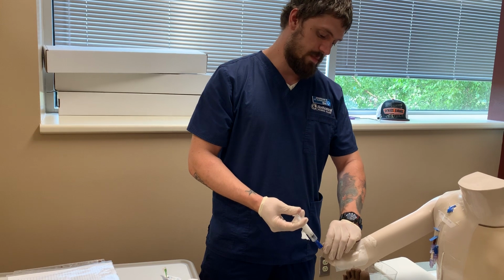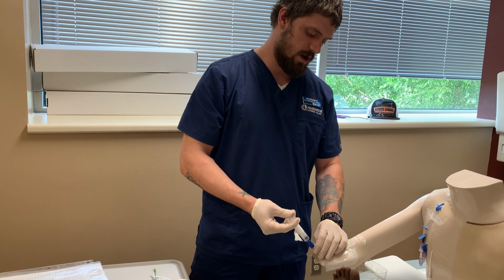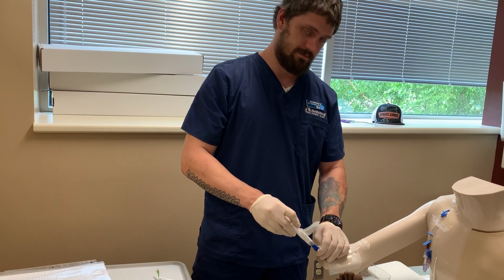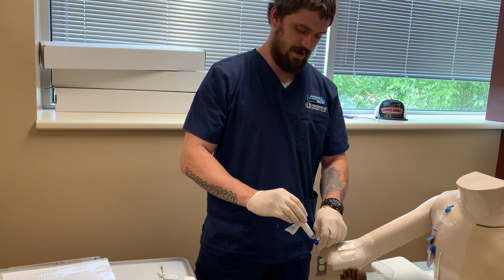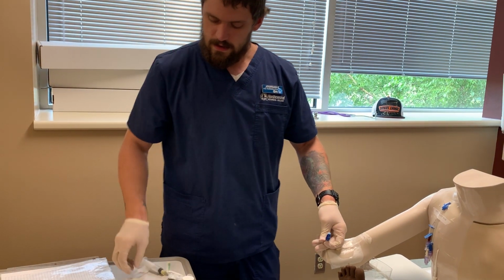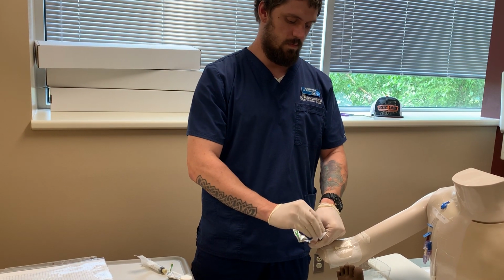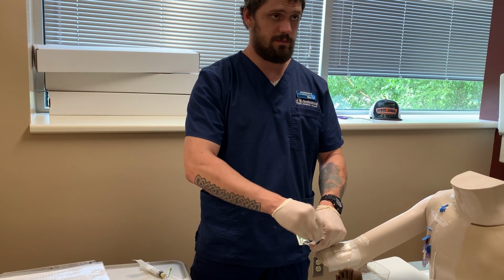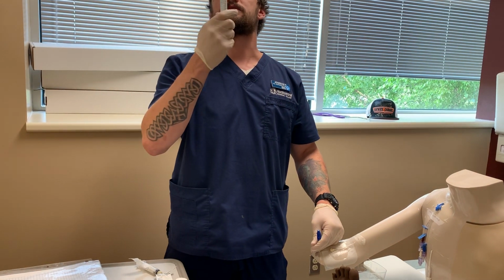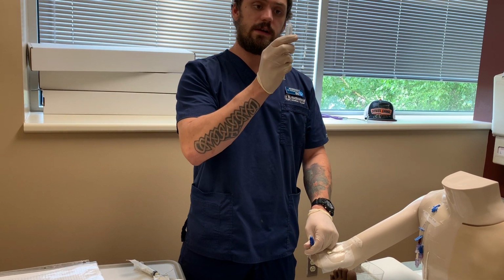After our 5 minutes is up, making sure to repeatedly check with our patient on how she's tolerating, how are we tolerating this, Ms. Doe? I am doing great, thank you. Awesome, I'm sure you are now. We will clamp and wipe with another alcohol pad for 20 to 30 seconds. And we have a post flush. And all the air is out.